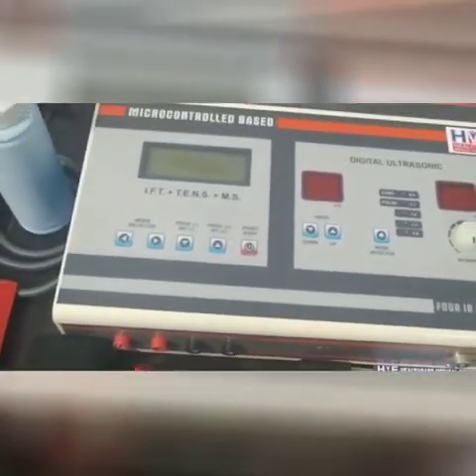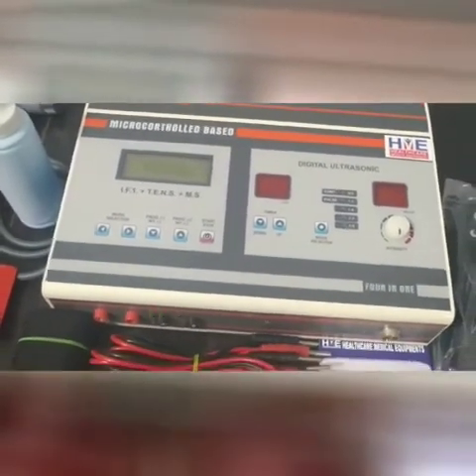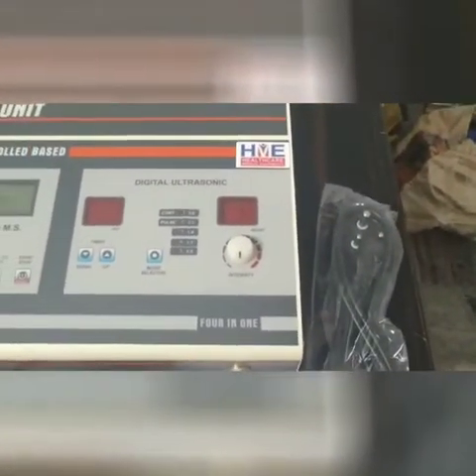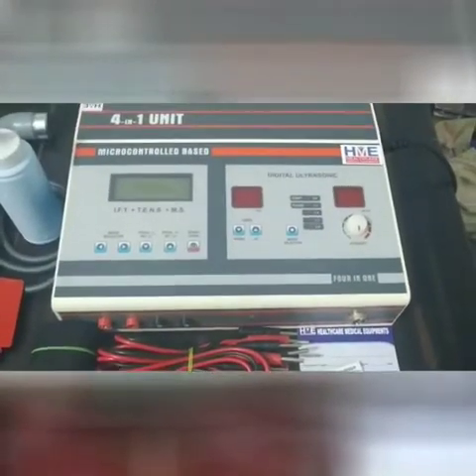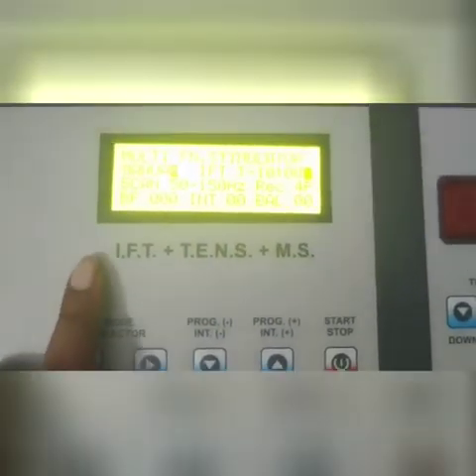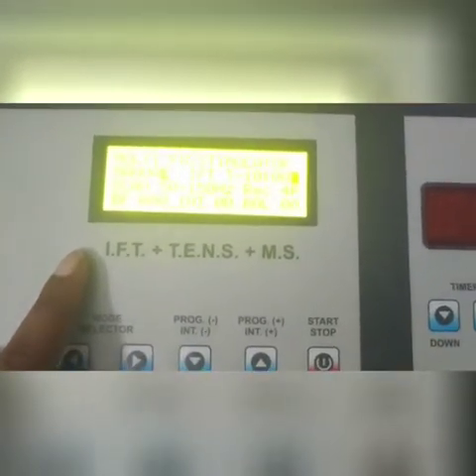Now I am going to start the machine. First I have to connect the main cord to the circuit — so let's do that. I have connected the main cord to the circuit. This button is for IFT, TENS, MS and this one is for ultrasonic. Let's start with IFT, TENS and MS. The machine has been started — as you can see here. There are 125 programs as I told you before.